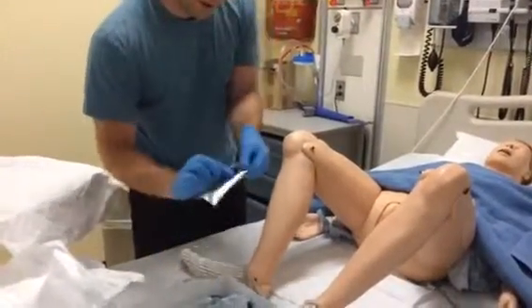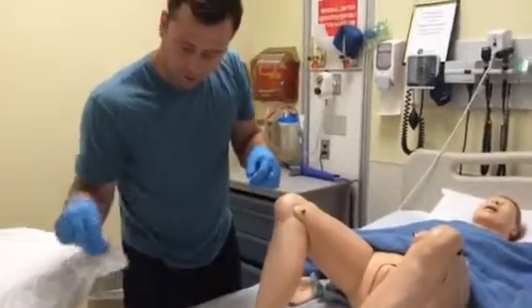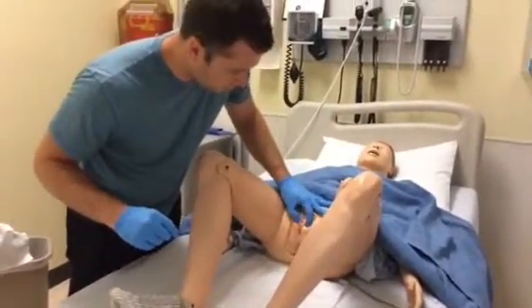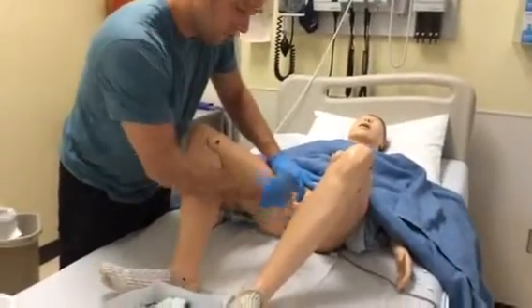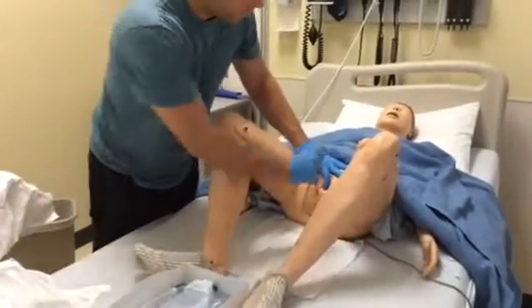And so I would use these iodine swab sticks. I would go ahead and open that up, and at this point, I would be all set to use my non-dominant hand to open up the labia, and I would hold it there, use one wipe down the right side, one wipe down the left side, and one wipe down the middle.